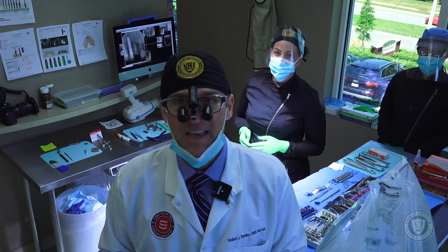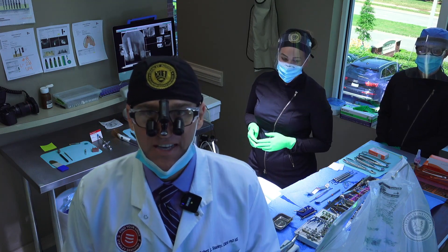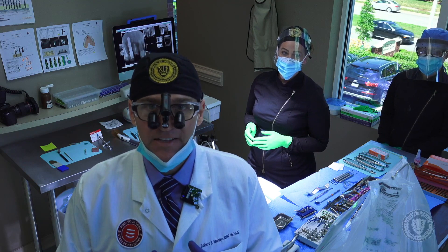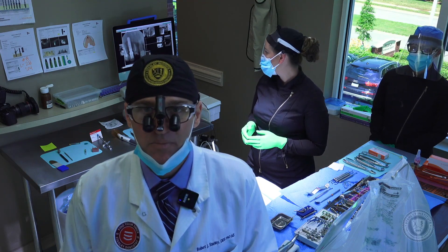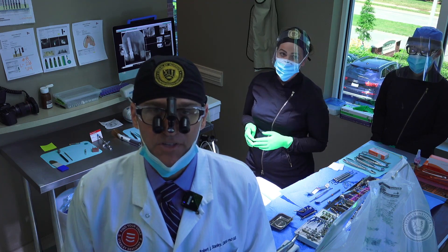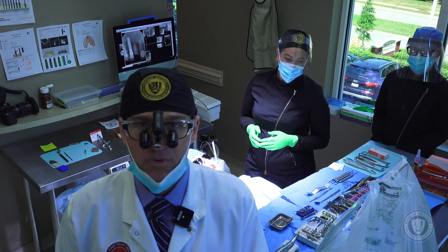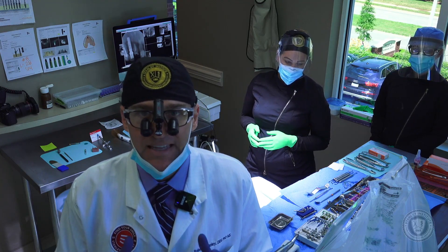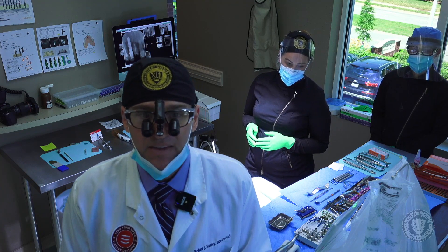Hello everyone, Dr. Robert Stanley here. Thank you so much for joining us today. We're going to get started here in just a second. Today what we're going to be doing is removing an anterior tooth in the aesthetic zone, using a fully guided system to place an implant. We're going to graft any gaps in position, and we've already prefabricated a long-term provisional that she will wear while she's healing. In the aesthetic zone, it's very important to maintain the papilla — a lot of what we do today surrounds that.